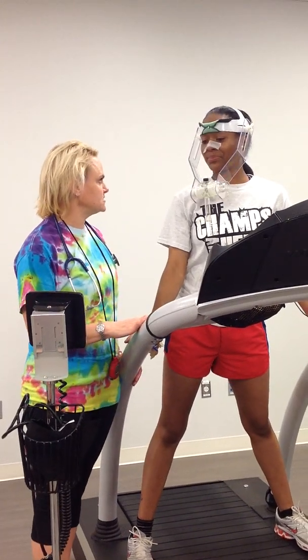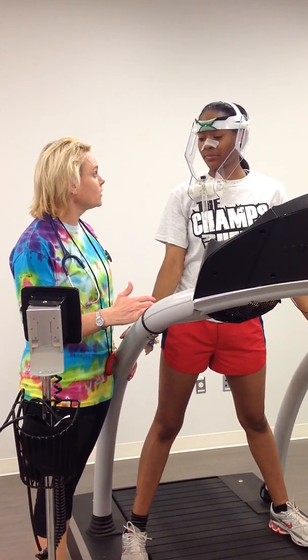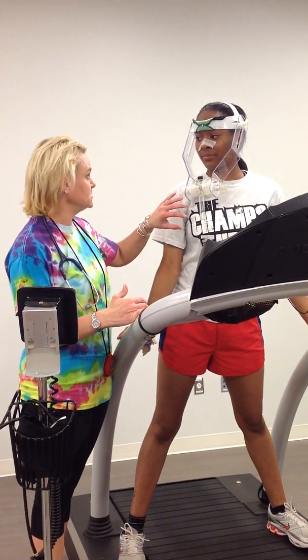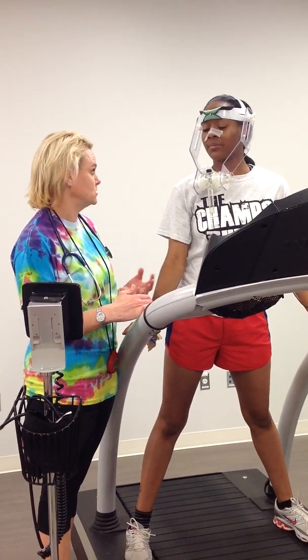Grace, today we're going to do your VO2 max test. During the test, this is a maximal exercise test, which means I need you to go as far and long as you possibly can. We're going to have this mouthpiece in your mouth. You're going to be breathing only out of your mouth, so we're going to have a nose clip on your nose to close your nose during the test.